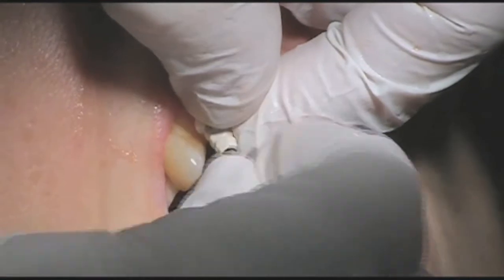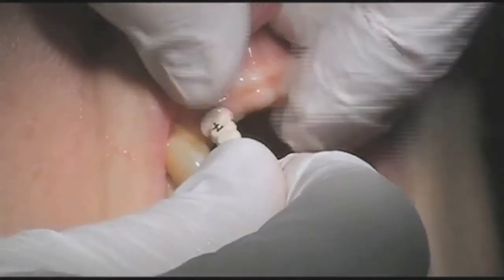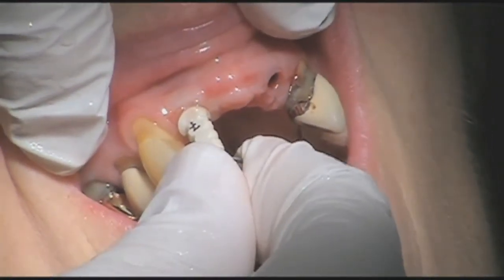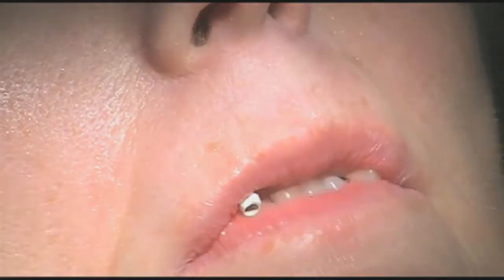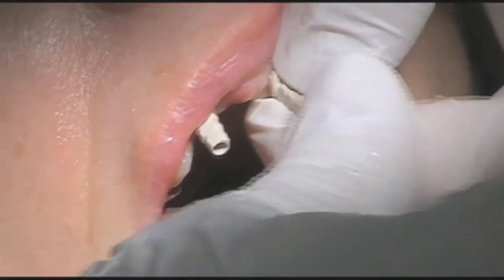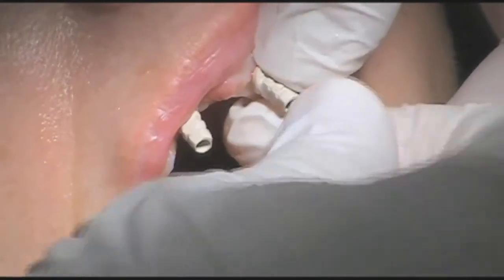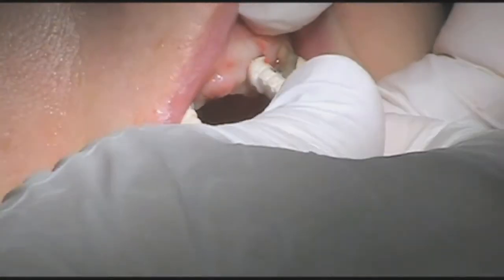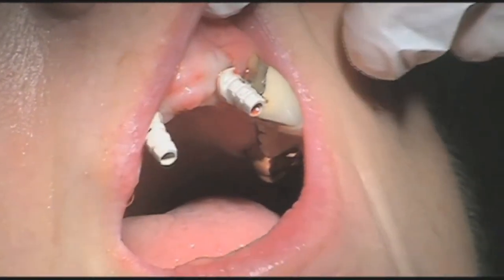If the surgical intervention is not excessively traumatic, a final impression could indeed be made using the custom impression copings provided by the lab. Again, all this was made prior to any surgical intervention. This allowed the laboratory to begin fabrication of the final zirconia abutments and bridge while the patient is healing. This is an optional step that can be saved for therapy following integration and tissue healing, depending on the circumstances. And again, this allows you a lot of leeway as the practitioner.